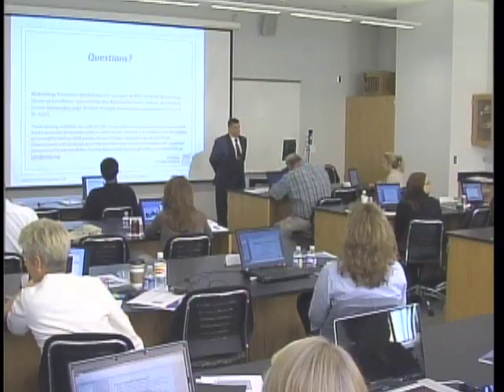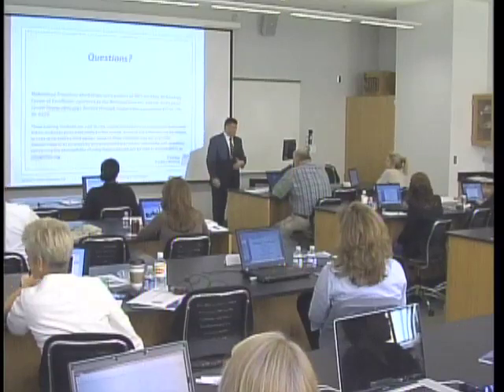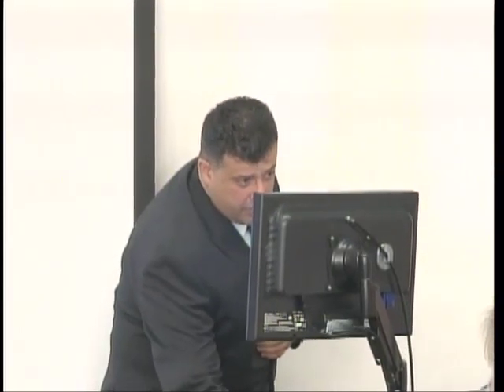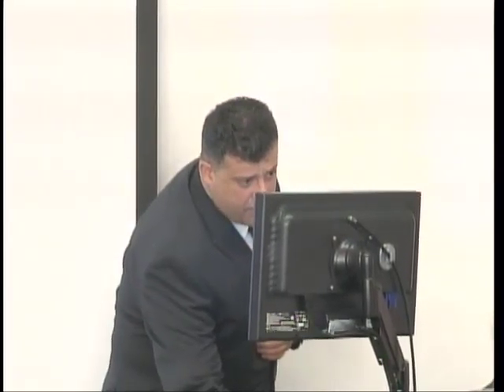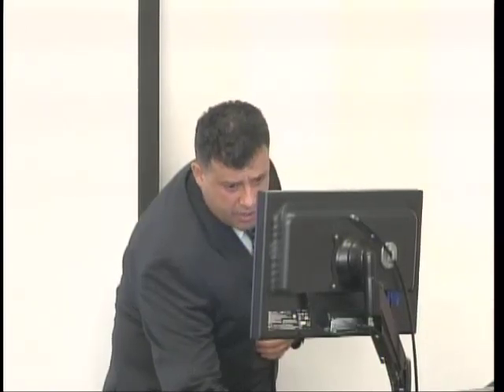Okay. Is it like a control? It is a control, absolutely. The Phantom has, I can go to the slide. The Phantom is a standard Phantom that technologists here use in calibrating CT machines. So they want to see the intensity, the energy, so they want to calibrate. I wish I had brought it with us.